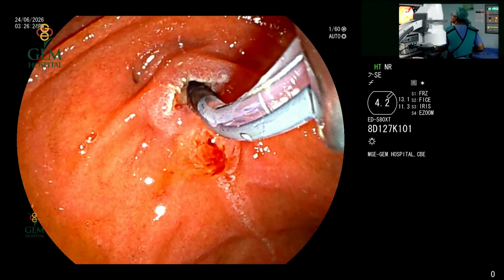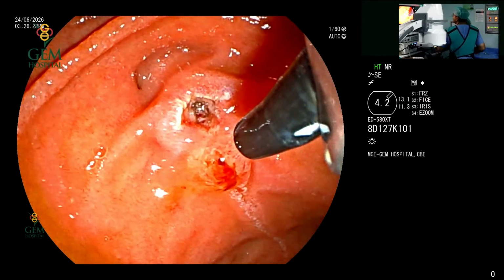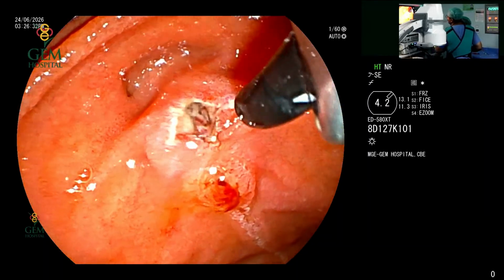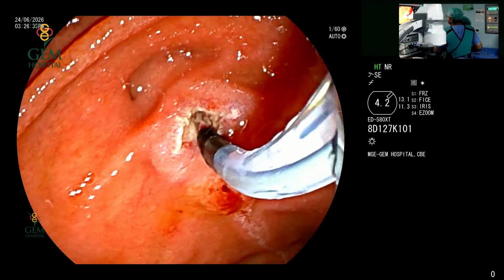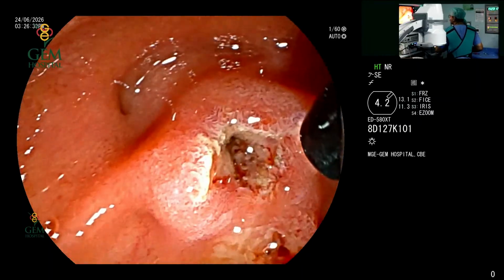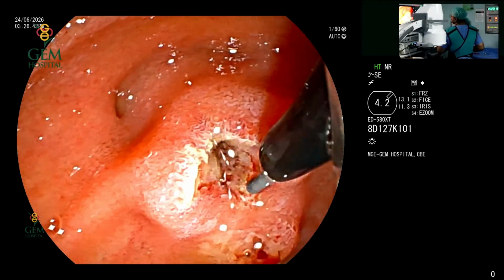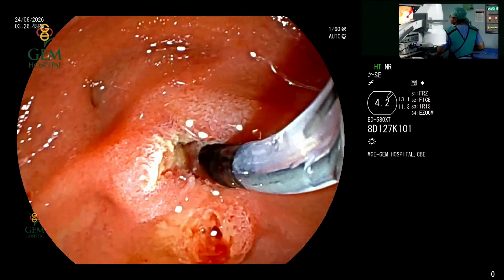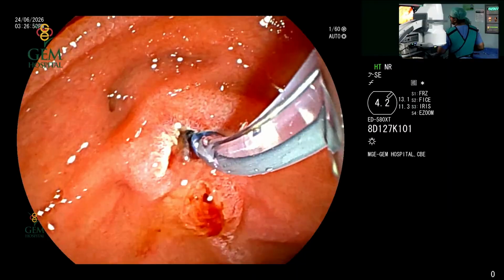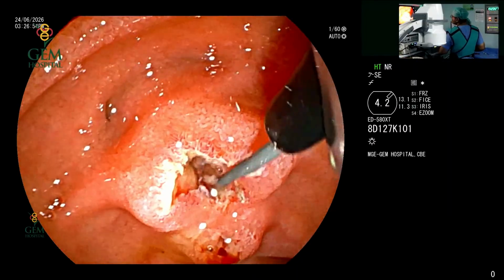Resistance is noted. No, it could still be a false track. We are not rushing in. We'll wash and cut this again. Please cut. Please wash. Okay. Can you keep the wire out? The wire still has a resistance. We are bringing it out.